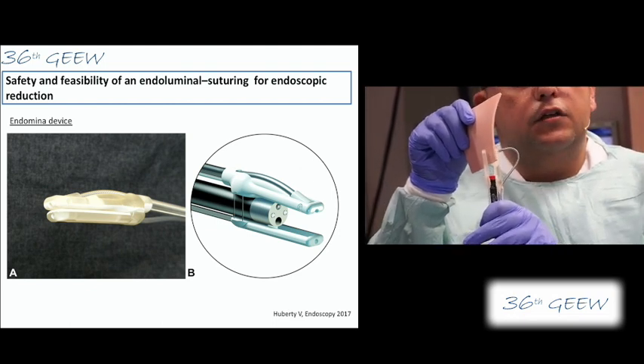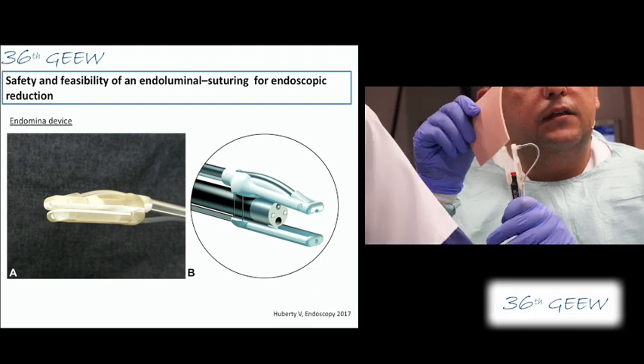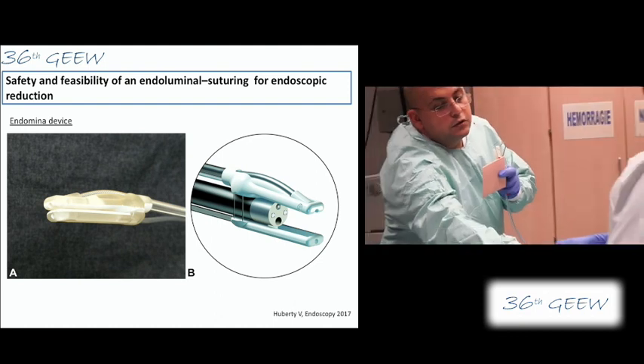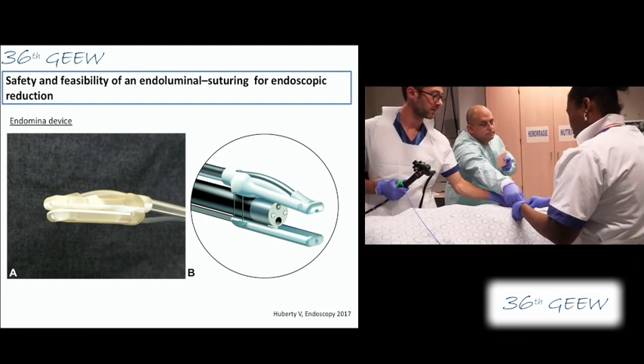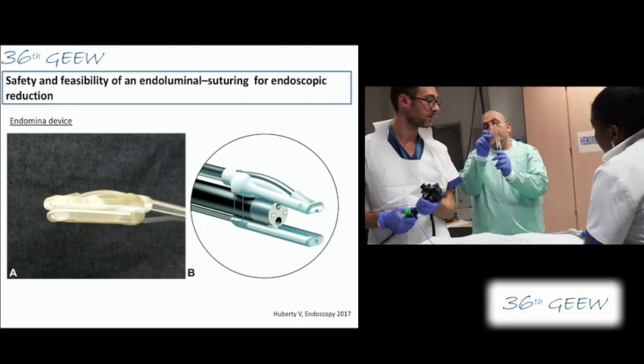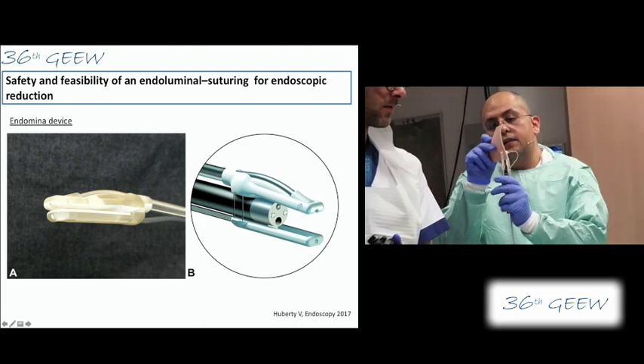Now we will pierce the first piercing and then we release. There is a security which — our nurse will push first the needle; you can see it.